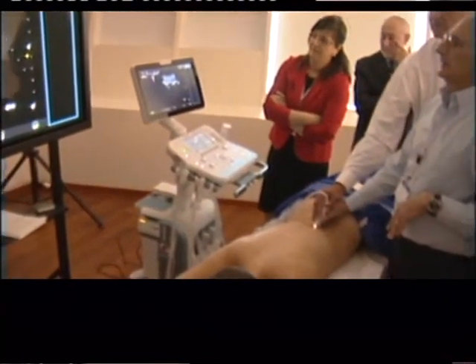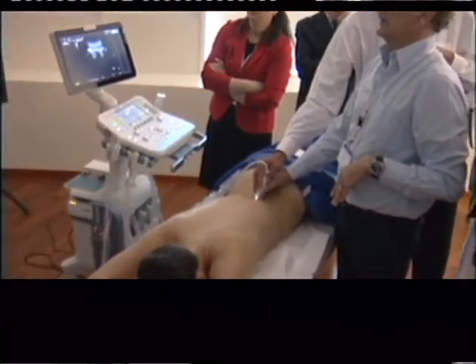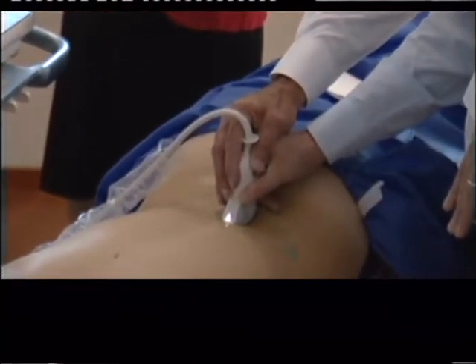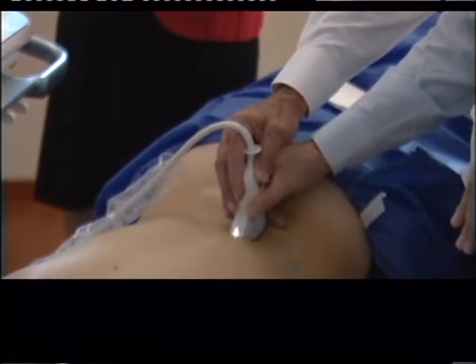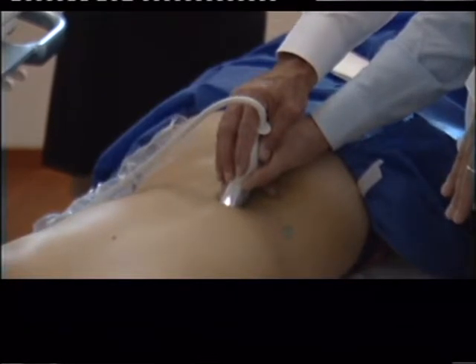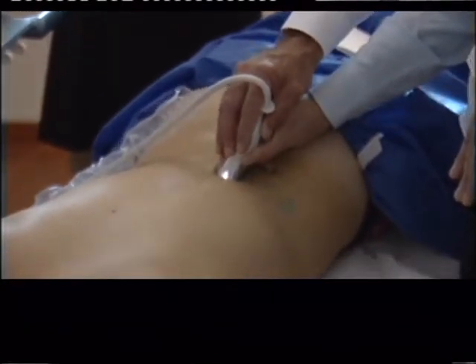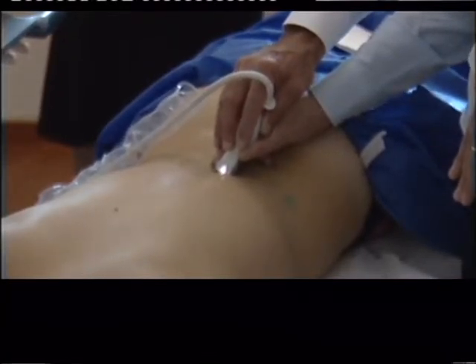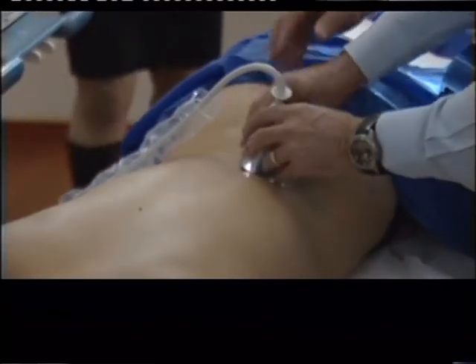Tilt inward. See? Lamina, facet, nerve root, transverse process, lumbar plexus. No transverse process. Transverse process, nerve root, facet, lamina, spinal canal.